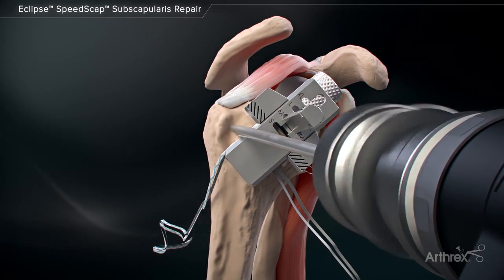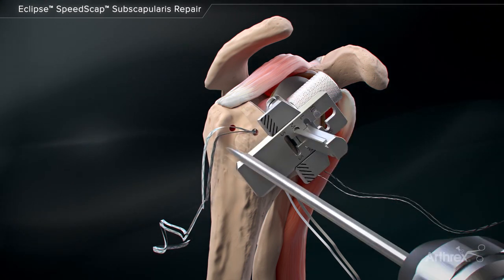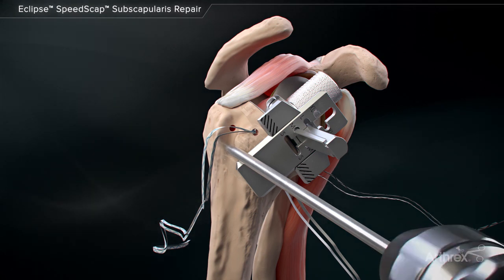Using the drill for the 3.9 mm swivel lock anchor, prepare two holes, adequately spaced, to cover the native subscapularis footprint on the lesser tuberosity.